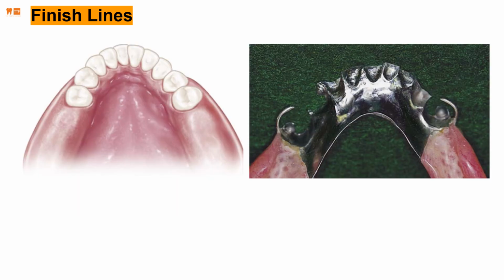So, finish lines. Where should a finish line be? This is a denture flipped upside down, exposing the tooth and tissue surface, known as intaglio.